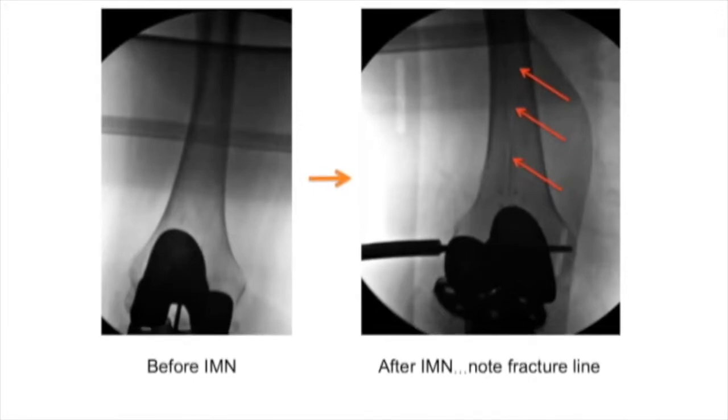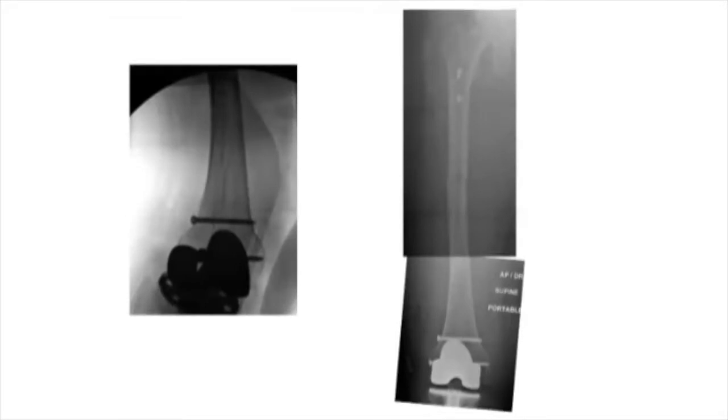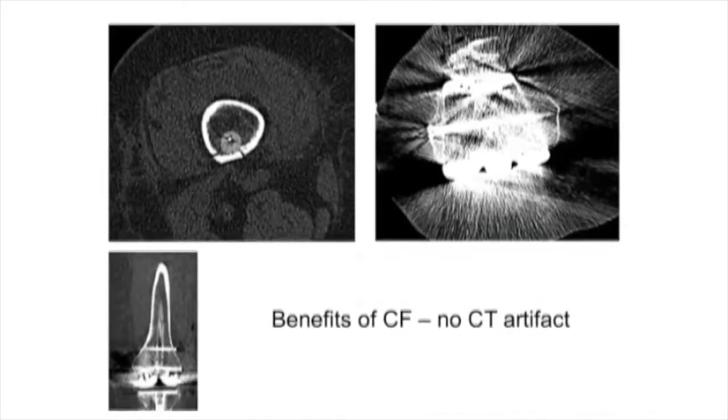And so because of this, I was concerned about how much extension there was within the metaphyseal region into the articular surface. I obtained a CT postoperatively. And the one thing you'll notice is this. Number one is I could clearly see the fracture, and I could see where it propagated because of the hoop stresses. But number two, you can also see that there's absolutely zero scatter in the picture on the left. Whereas when you get down to the metal implant, there's a tremendous amount of scatter, and there's absolutely no information you can glean from this. And so this allows you to not only see if there are any iatrogenic fractures that you may potentially generate as a result of your surgery, but also allows you to dictate the weight-bearing status for her. Because the fracture is still within the metaphysis, I still allowed her weight-bearing, and she healed fine.